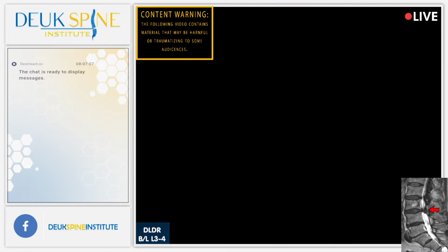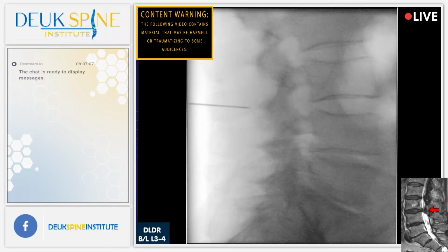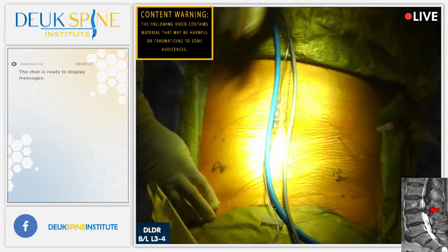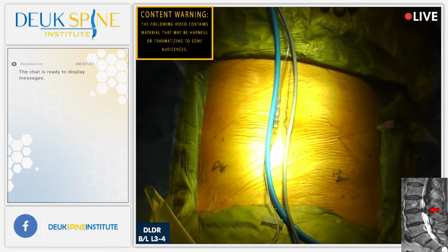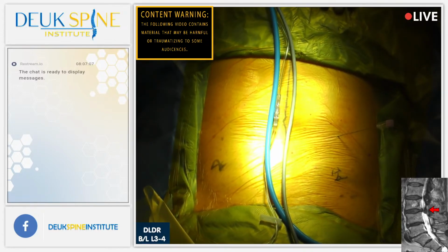And accessing the surgical target is the first part of any surgery. Of course, there's positioning of the patient on the table, prepping and draping, and the anesthesia, what's already done. But once you get to this stage where the surgical area is exposed and prepped and draped, then the next step is accessing, or what we call exposure.